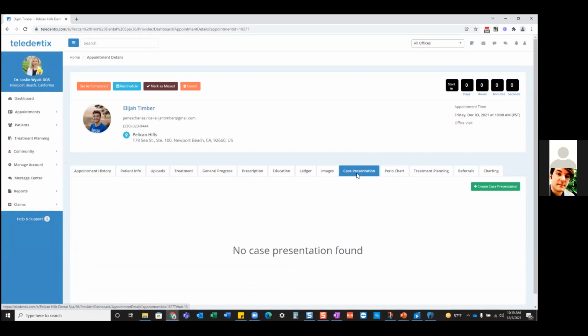Now, the case presentation I actually favor just a little bit more, because what a case presentation does is it allows me to kind of wrap everything up beautifully. Think about it as, if I'm sharing the images, I'm just kind of giving you the gift. You're going to like it, you're going to love it, but a case presentation, I'm wrapping it up. I'm taking the time to really make it a beautiful presentation. And that's exactly what the case presentation does.